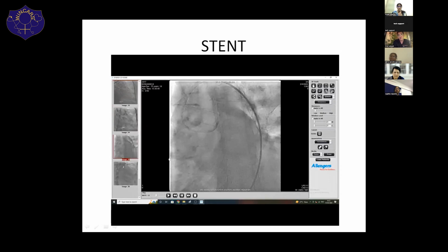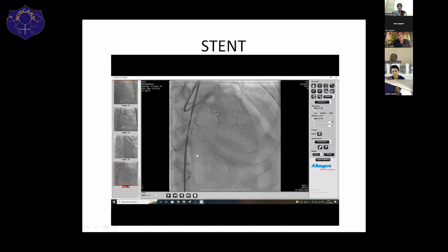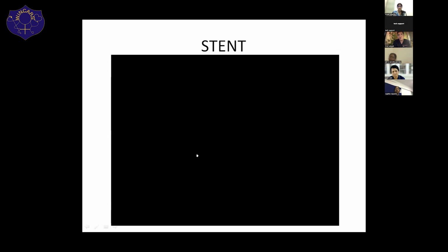So one more thing we can discuss about this case is ideally you should do these cases on mechanical support, because something goes wrong. You just do a right heart cath, see pressures, because it's the LV dysfunction, ACS, left main scenario, left dominant system. So if something goes wrong, your patient might crash on table. So kudos, you could bail out your patient without having any kind of support, but ideally, if available, we should think of mechanical support in these kind of cases.